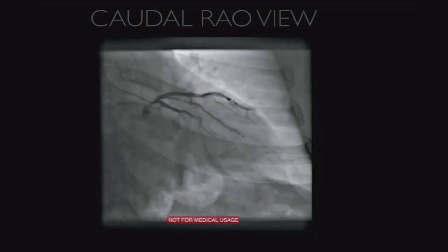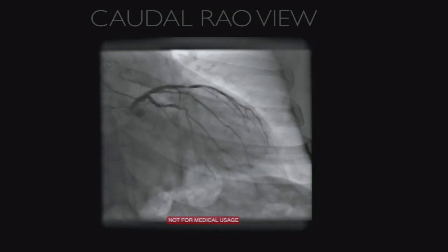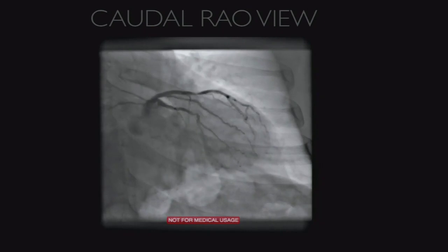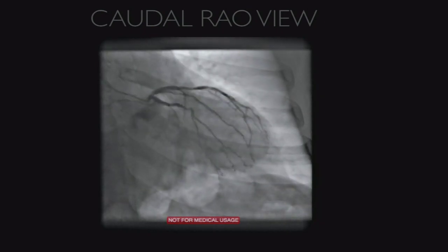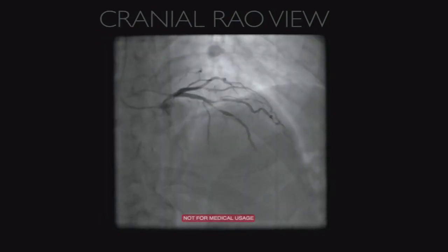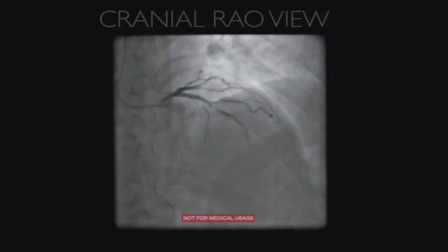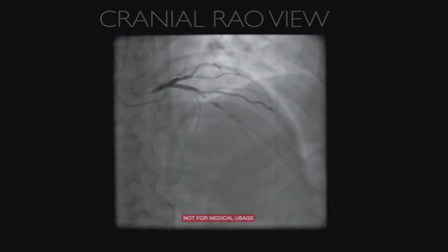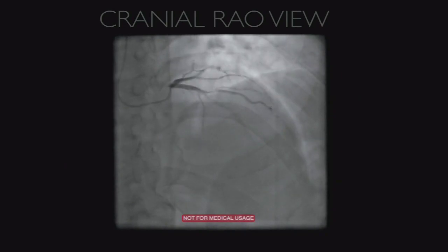So I'm just going to show you an example. This was a patient who was 83 years of age that we did with the first generation of the hydrophobic OptoWire. And as you can see, there is a moderate lesion on the LAD. So it's quite an old patient who presented with unstable angina de novo with rapidly progressive symptoms. As you see, there is basically a tandem lesion on the mid part, and there was also some lesion on the diagonal. For the sake of the discussion, I will focus just on the LAD.